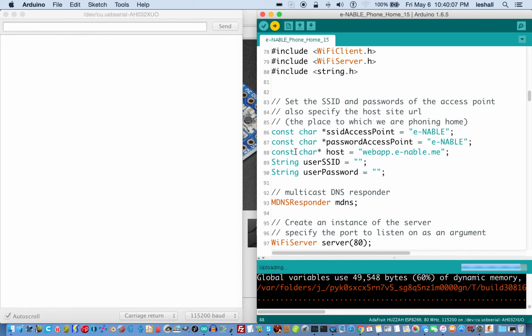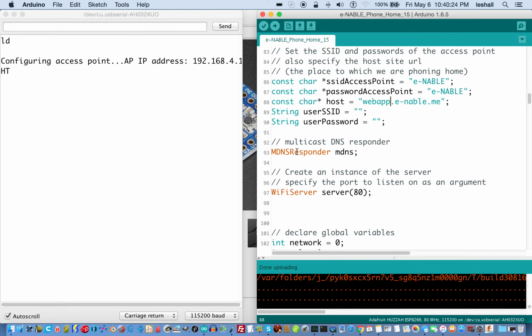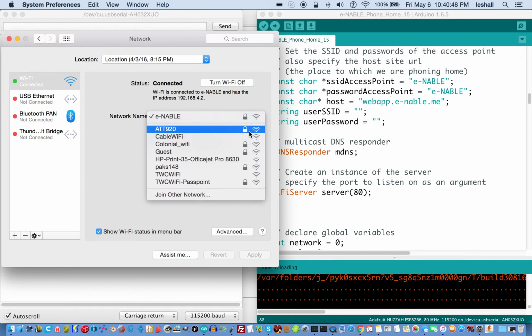Once they're done, the ESP8266 chip will wake up as an access point. And that means that it shows up in the list of Wi-Fi access points. Here in the serial monitor, it tells us the IP address 192.168.4.1. If we didn't use the serial monitor, we can go to our network preferences where we have previously selected e-NABLE, and you will have to select it from this list.